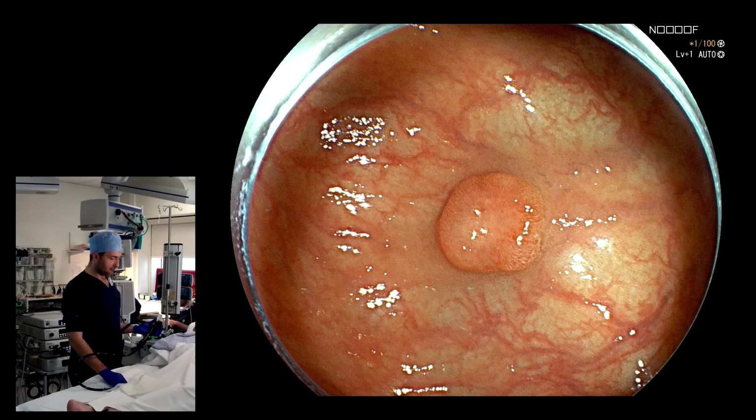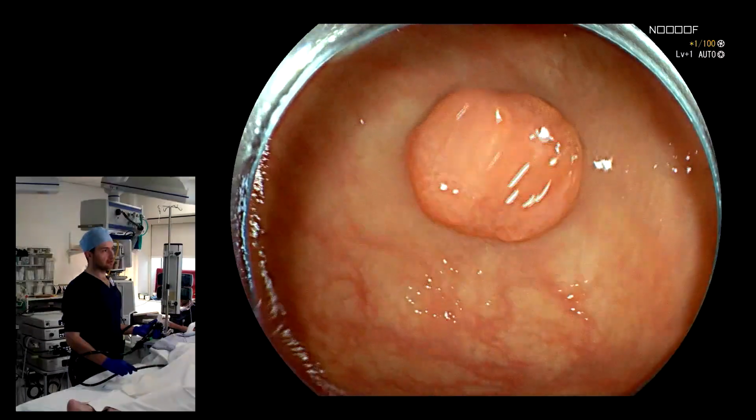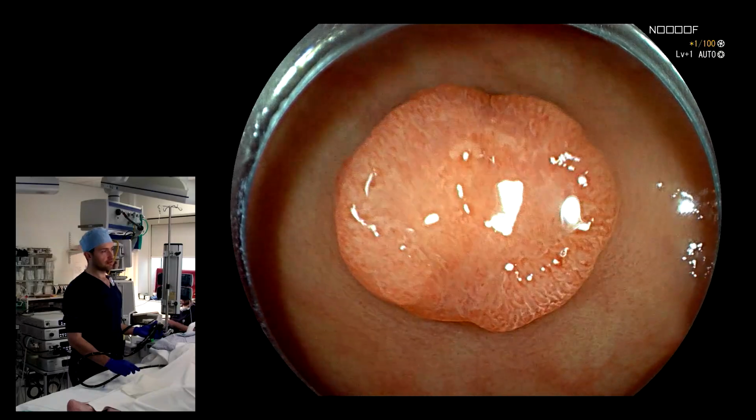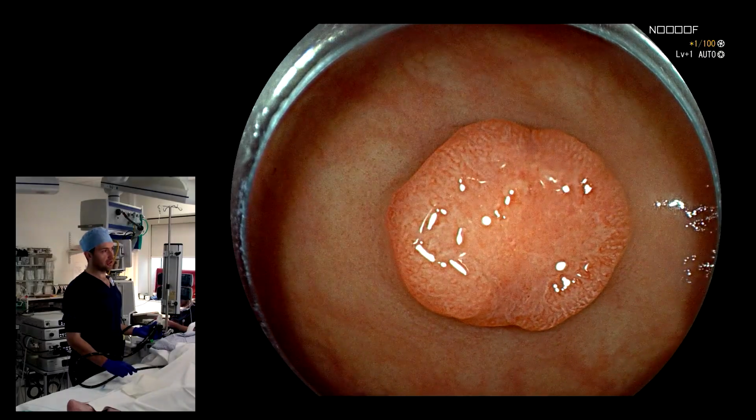Okay, welcome. So this is an interesting polyp. You can see it right in the center of the screen. We go up to it a little bit and then get closer. So let's just think about analyzing it. So it has a very punched out appearance.